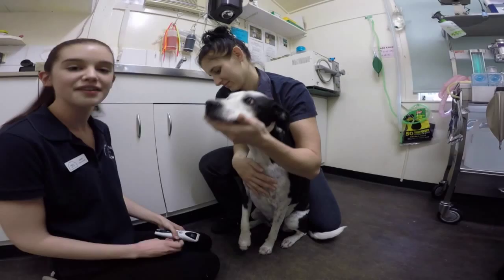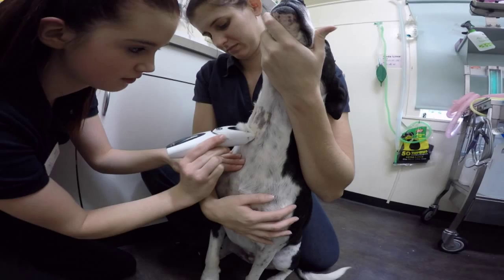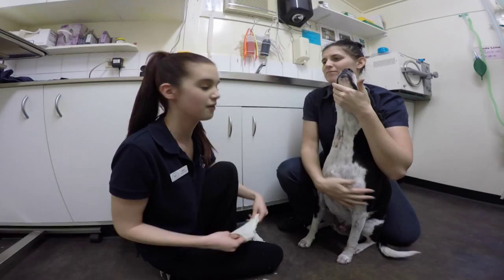Now that my patient is in position I will clip a small patch of fur so I can see the area. I will now disinfect the area with the alcohol swab. Once I am ready to take the blood I will pop on my gloves.